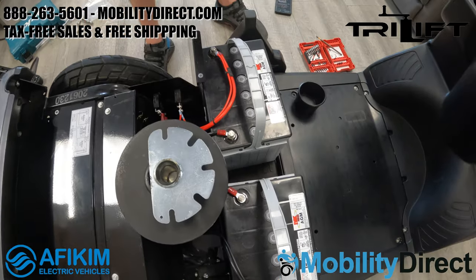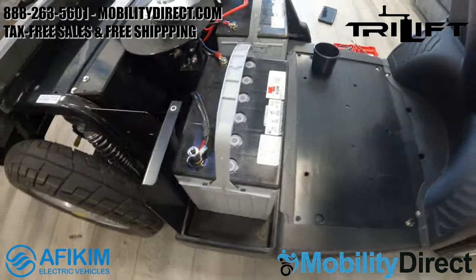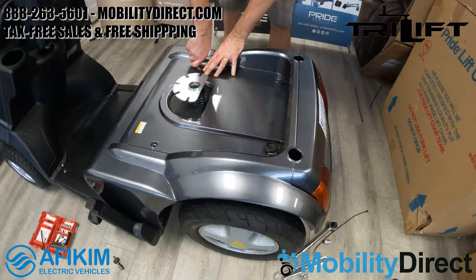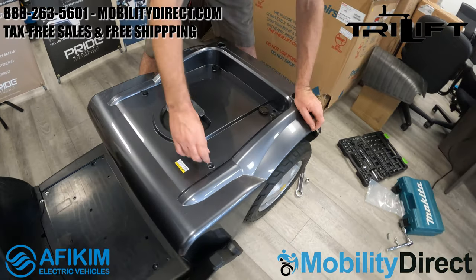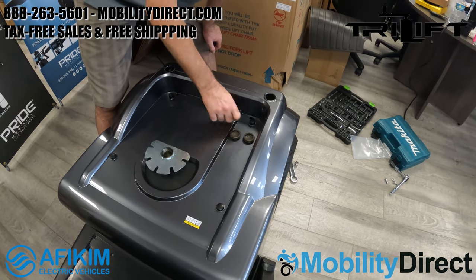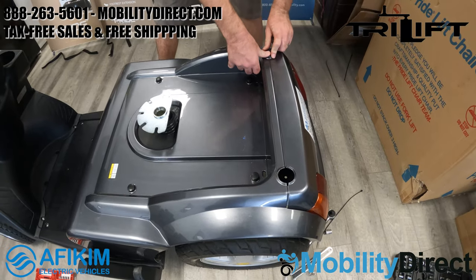We've reinstalled the batteries — just reconnect the bolts for the terminals and make sure they're wired up correctly. Pay close attention to the wiring configuration when you take it apart. We're reinstalling the shroud cover for the batteries now, including the little hand screws and the little circular caps in the back. Make sure those caps are replaced, the battery shroud cover is seated correctly, the four screws are nice and tight, and the little rubber grommet around the seat post is installed correctly to keep debris out.